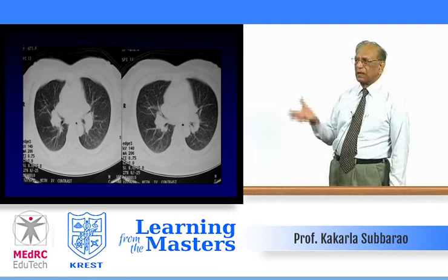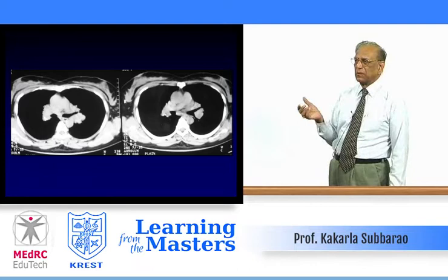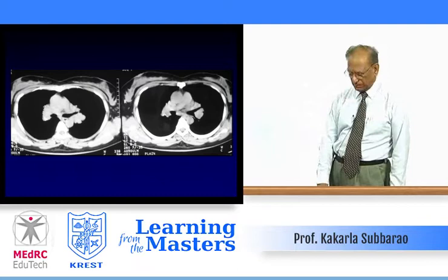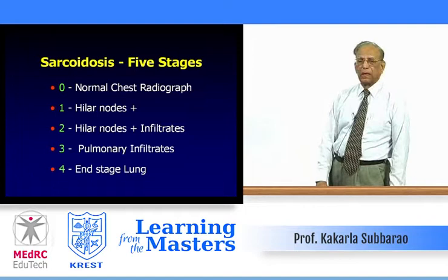Going to CT, the hilar nodes are enlarged with few interstitial changes in the lower zones. Another section shows the enlarged hilar nodes. Also note the calcific density in the right hilar nodes — well seen in the close-up view showing multiple calcific densities in the right hilar nodes. Diagnosis is sarcoidosis.